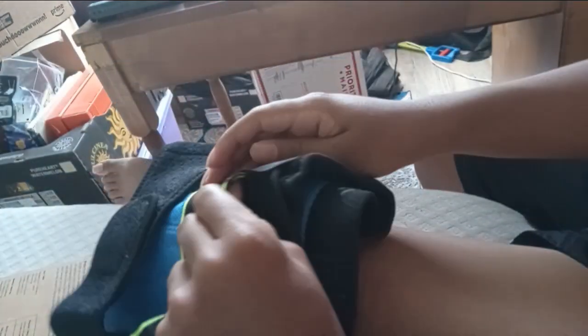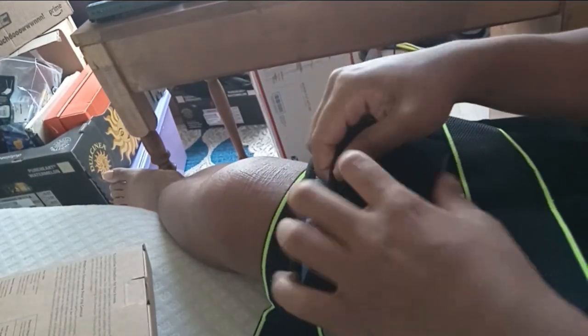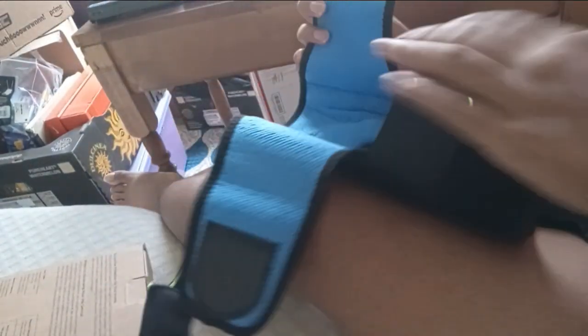Alright, so here's the brace. This should be the right size for me because they just come in two sizes — regular and extra large. Got some cute straps. I'll just smooth and place it over my kneecap like this.